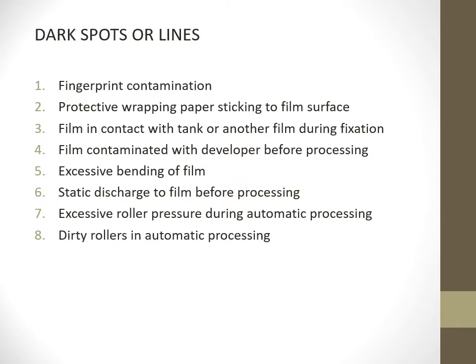Excessive bending of film. See to that the films are not bent much, otherwise it causes dark lines. Static discharge of film before processing. You are not supposed to hold two or three films together, I told you. Excessive roller pressure during automatic processing. That is, this happens in automatic processing, where excessive pressure during processing causes dark lines or spots.